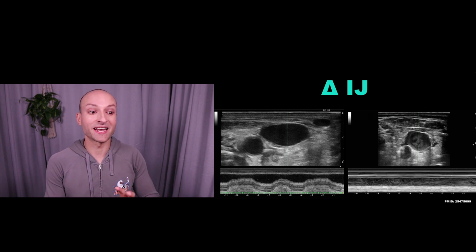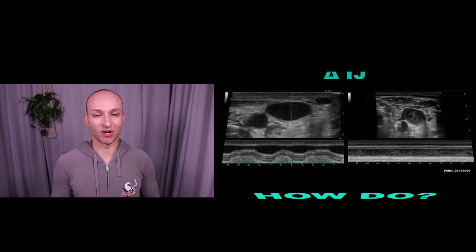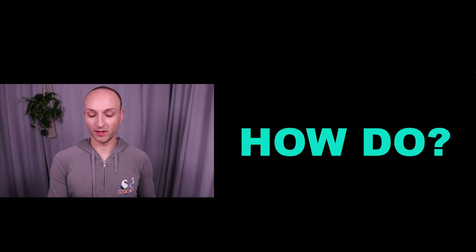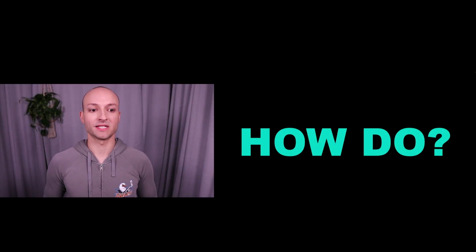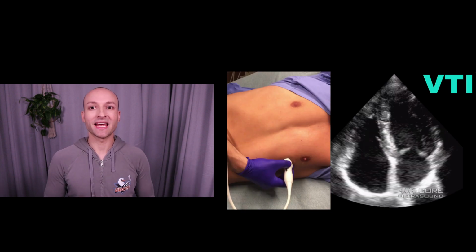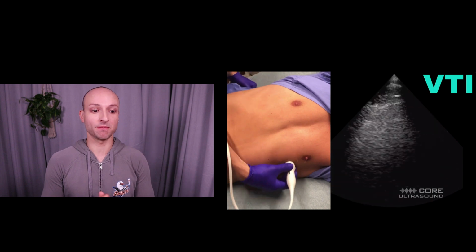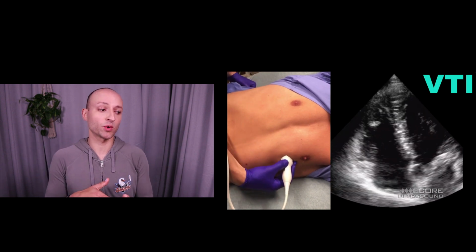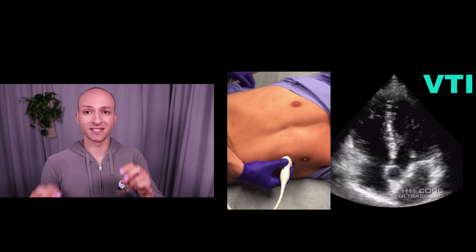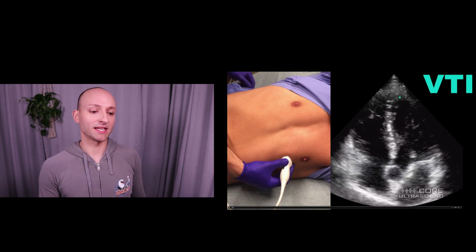All right, now that you've had an introduction on how this all works, let's talk about exactly how to perform this examination. Let's start off with getting your LVOT VTI. To get this view, you're going to want to get your best apical 5-chamber view. So what you do is you get an apical 4 and you're going to tilt your transducer ever so slightly down towards the feet, and you're going to get this 5th chamber, which is the LVOT.